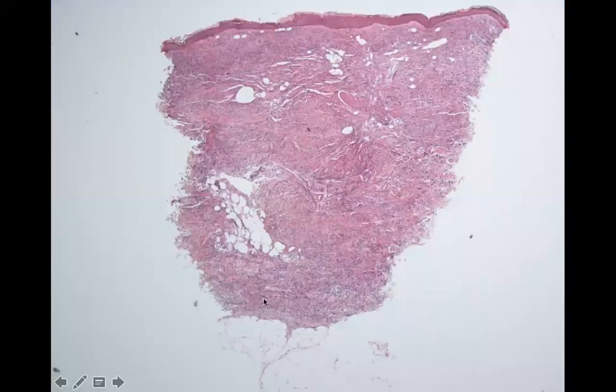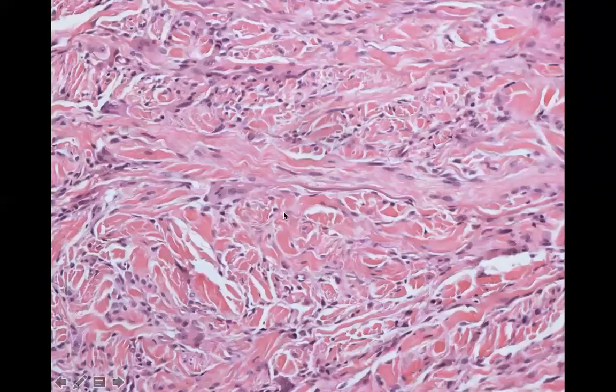So this is a case, and you can see it's a very busy dermis. And when you look up close, all of these cells are fibroblasts, okay? It's a significant increase in fibroblasts, which is why I put it in the fibrosis chapter. But there's also a significant deposition of mucin, so some people put it in the depositional chapter. There's different ways to skin a cat. You might see a few giant cells, but fibrosis, increased mucin, you think about NSF and you think about scleromyxedema.